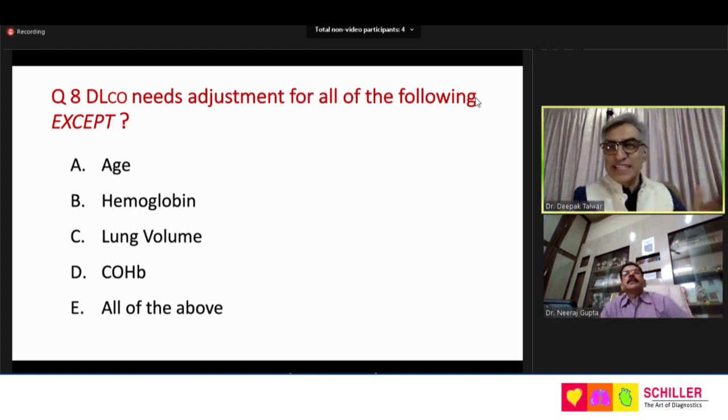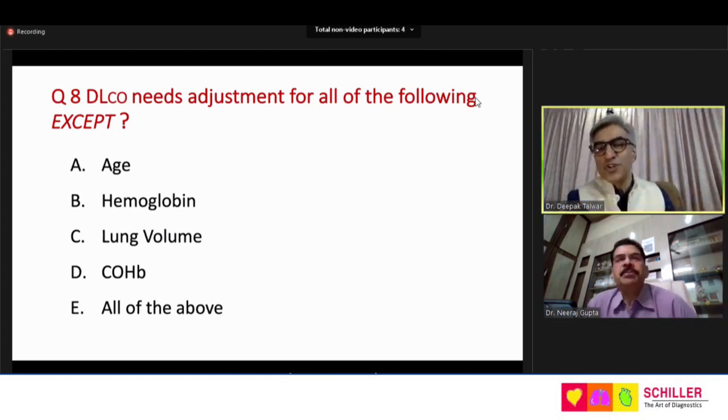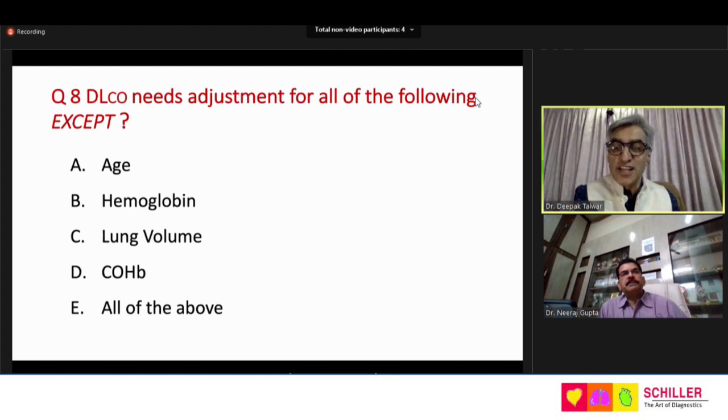So that was the preceding slide. I'm pretty sure that those who did not consider hemoglobin and lung volume joined late, because initially we started saying that the 2 important determinants of diffusion capacity are hemoglobin and the lung volume. So we presume that the lung volume is good, acceptable, and hemoglobin is also 13.5 to 14, which is taken for females and males. If that is not there, you need to correct it. Otherwise your values are going to be of no use.